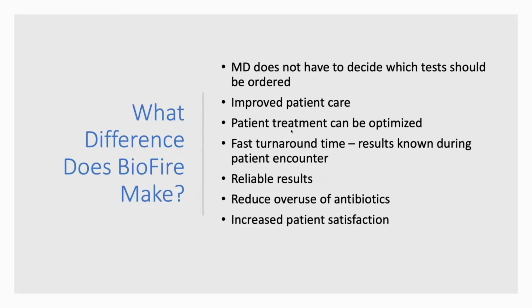we also said, why, also explain to them what is the difference that having BioFire makes, okay? Because remember, before BioFire, right, the conversation is the emergency room doctor calls me and goes, hey, I think I have someone with meningitis. What test do you want me to order? Okay, and we have this conversation of, well, I think we should order this, I think we should order that, and then I'm hoping they're going to order all these tests, right? So the idea of having this rapid diagnostics and being able to have pathogen identification allows us, number one, to have improved patient care. And as Arpad has said, that is the key and the number one reason for everything that we do, right? We can also optimize treatment.